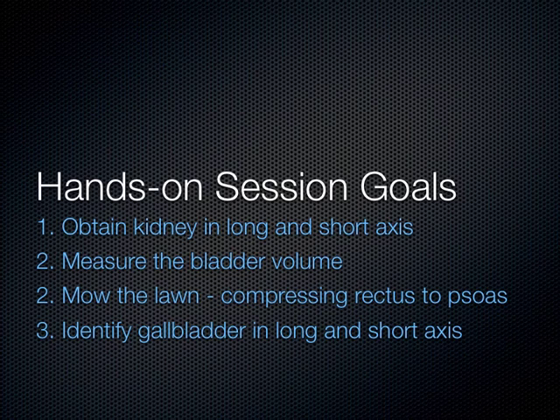You're going to mow the lawn, compress, get that rectus abdominis muscle to come all the way down, to come in contact with the psoas muscle, and then I want you to show the gallbladder's long and short axis. Any questions about this talk?